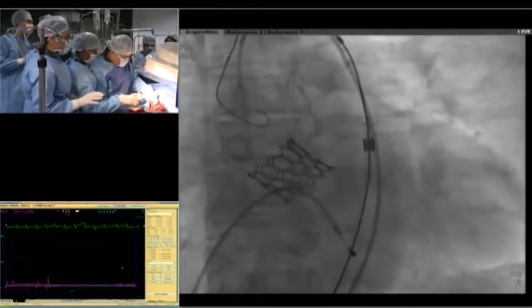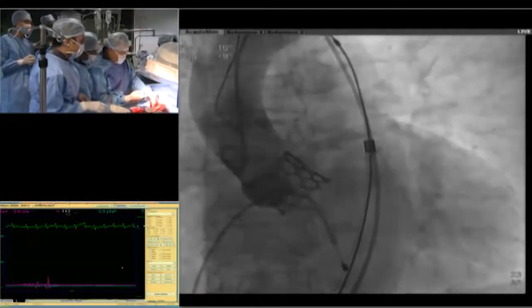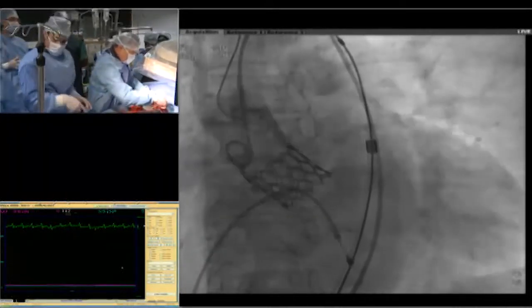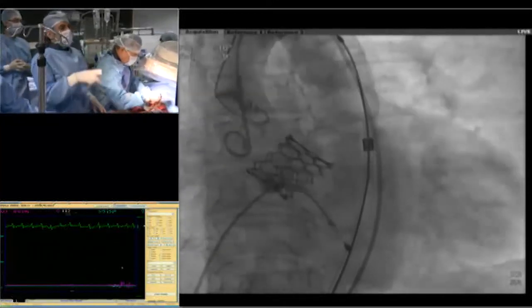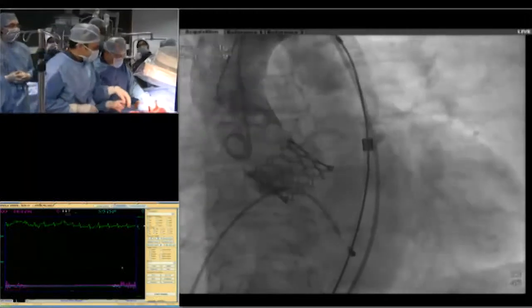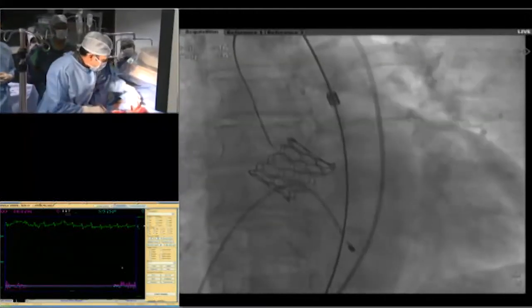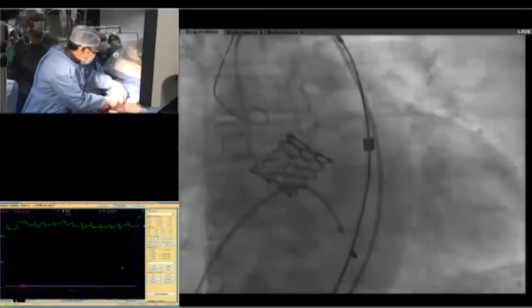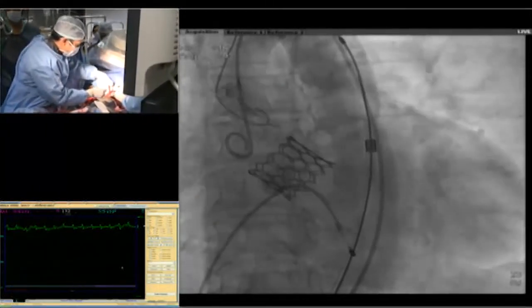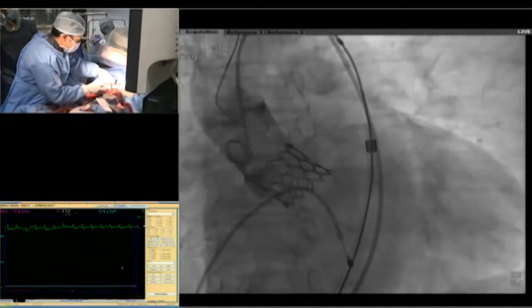I think what we're going to do is deploy the ProGlide first. Go ahead. Wire is important. Show us the previous picture. We need to put one more. The ProGlide is lost. The wire is lost there. So it's a problem. Wire is lost now, so we can't put the ProGlide there. That's okay. Do you want to deploy one? I have already deployed one. That's good. We'll wait.